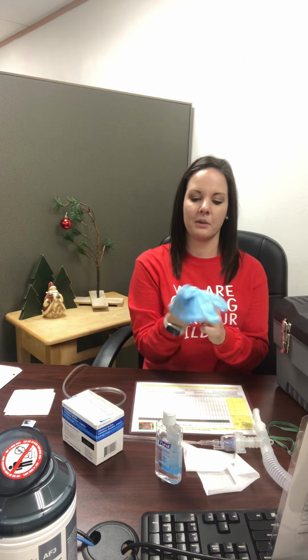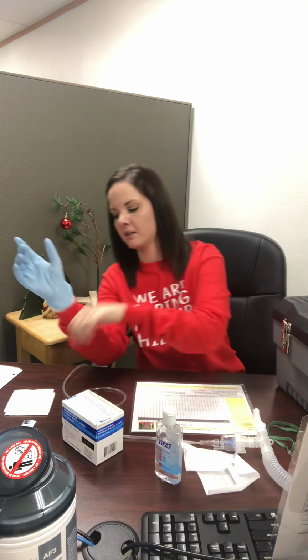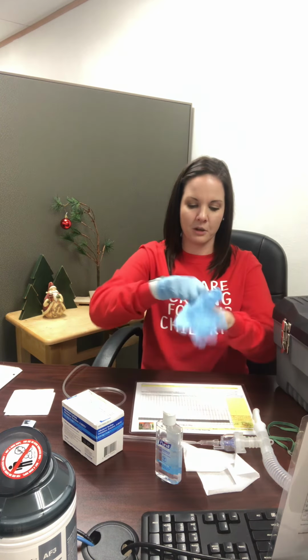So we are going to take our medication and our supplies to Joey and explain the procedure. And we will do our third medication check. And we have the albuterol sulfate nebulizer solution. We're going to give 1 vial via nebulizer every 4 to 6 hours as needed for asthma. That matches our monthly medication record and our parent authorization form. So we are going to put on our pair of gloves, and we are going to position Joey comfortably.